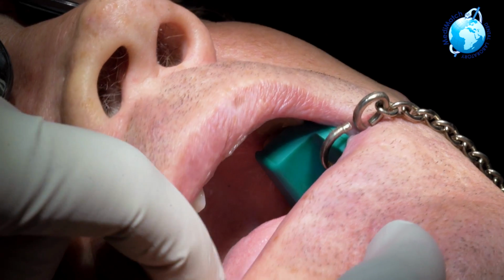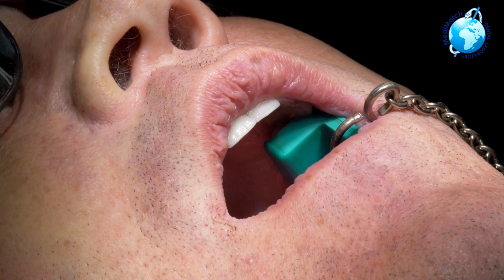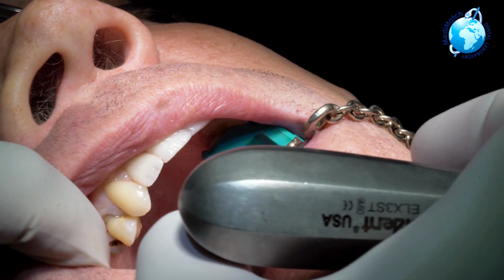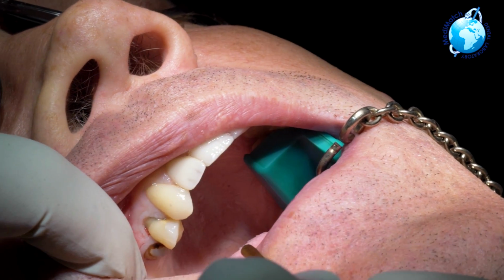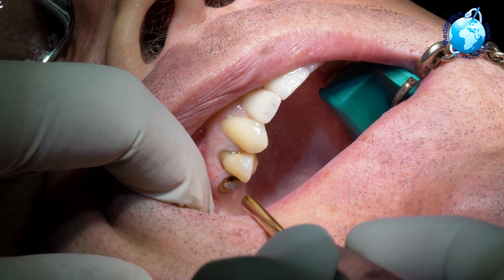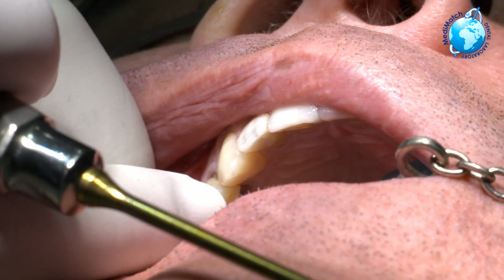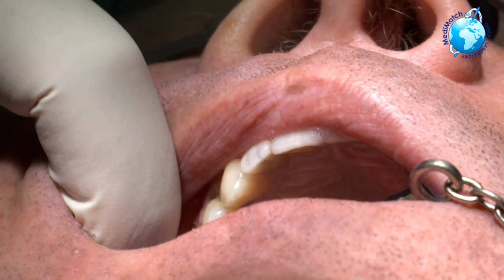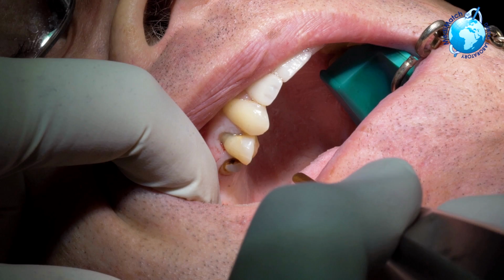Very well. Great. Okay, so this is Alan, our patient for today, who's having some implants with me, and we're just doing some extractions on the top right of some retained roots and some teeth which have inadequate coronal structure. So Alan's under very mild sedation and we can talk to him. So you okay, Alan? Perfect.